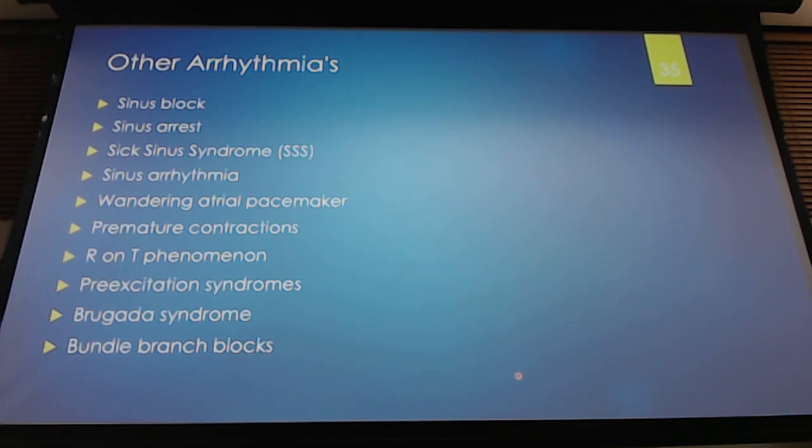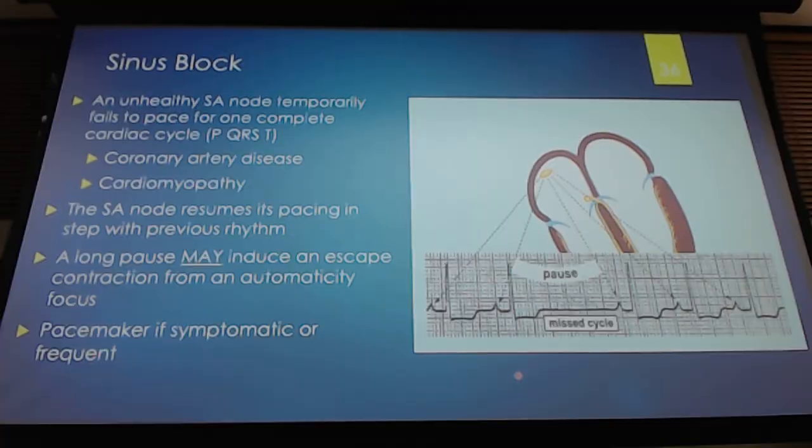Let's talk about some other arrhythmias that you might see. Okay, so quite a few different things here. We've got sinus block, we've got sick sinus syndrome, which hopefully you will never see, and then we'll talk about a couple other things.